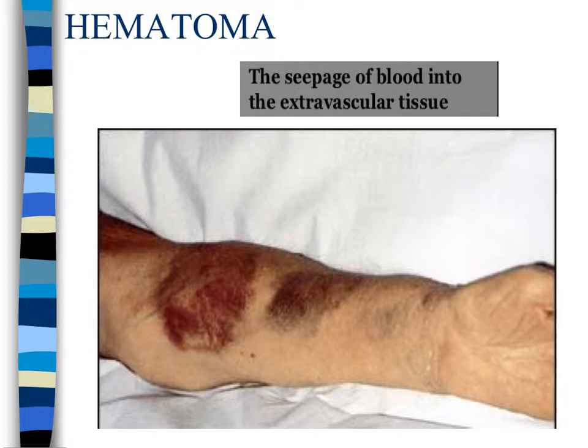Signs and symptoms of a hematoma include ecchymosis, which is discoloration surrounding the venipuncture site, and that can be immediate or slow, site swelling and discomfort, the inability to advance a catheter, and resistance during flushing. Nursing management includes removing the catheter, applying pressure with a 2x2 for 2 to 3 minutes, elevating the extremity over the head, or placing it on a pillow to maximize venous return. Ice may be applied to prevent further enlargement of the hematoma, and we don't use that site again until it's completely healed.